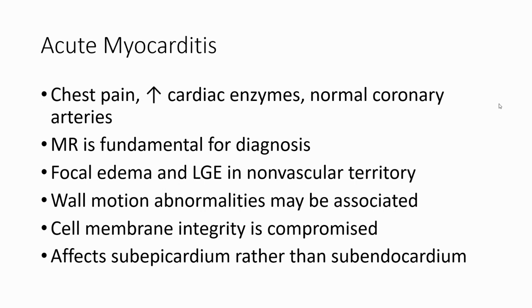Acute myocarditis. Clinically there will be chest pain, increased cardiac enzymes, and normal coronary arteries. MRI is fundamental for diagnosis, showing edema and late gadolinium enhancement in a non-vascular territory. While wall motion abnormality may be associated, cell membrane integrity is compromised. It affects the subepicardium rather than the subendocardium.